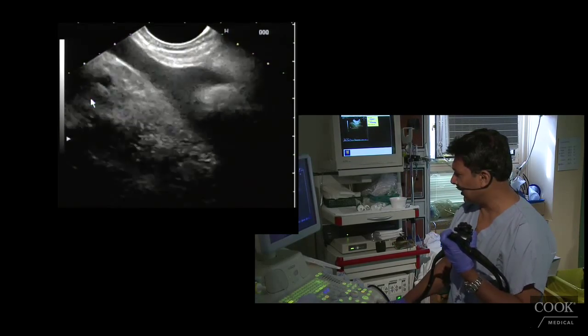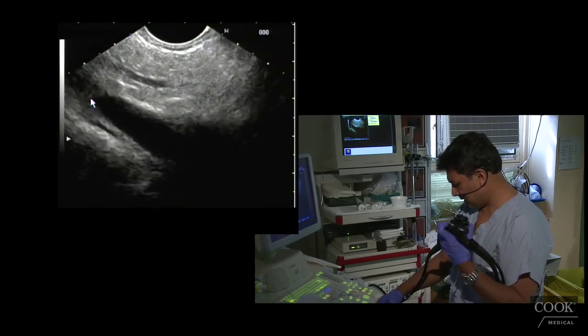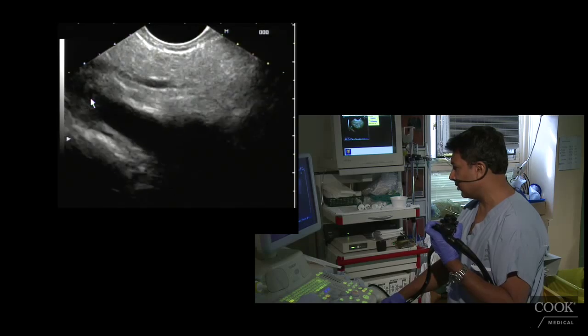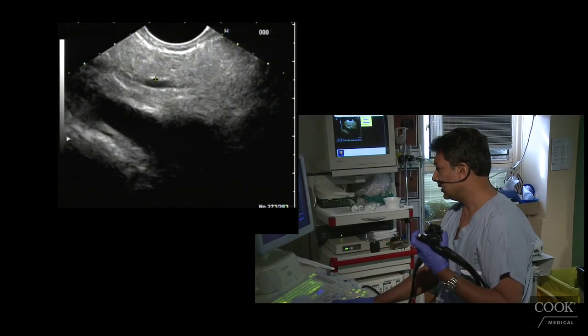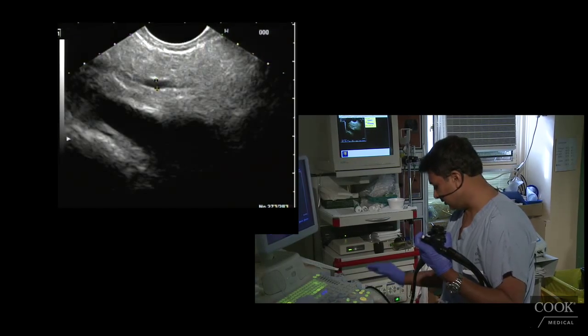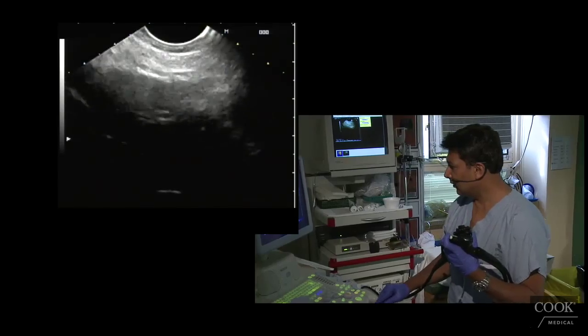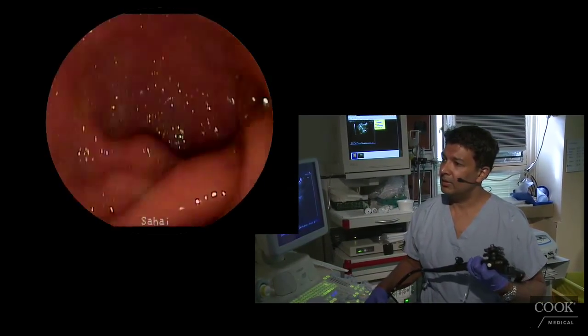So far, I'm not seeing anything that looks really... There's a nicer view of his PD, which is prominent. But smooth, okay, and let's measure it too, which is pretty much within normal limits. Okay, so let's go into the bulb, endoscopic into the bulb.